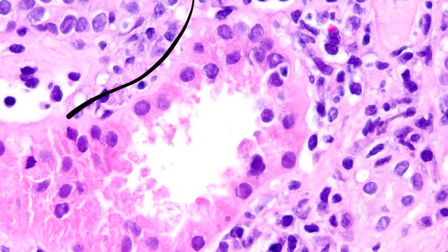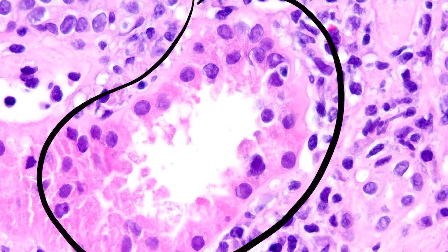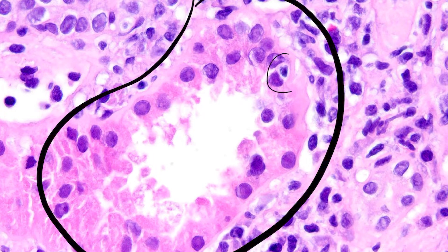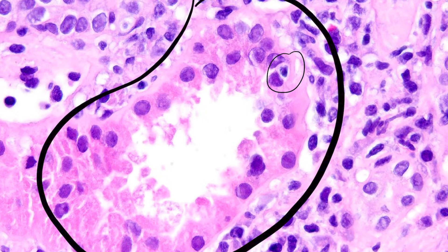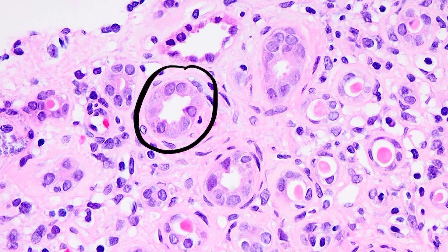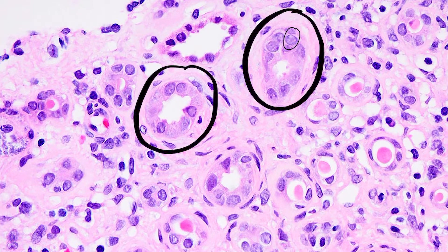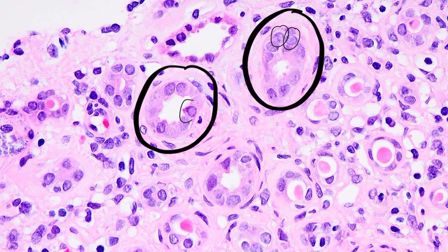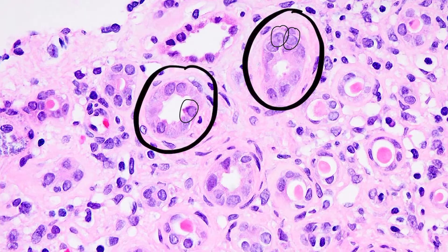In addition, we had frequent non-atrophic tubules that showed lymphocytic tubulitis, which at first glance would be concerning for acute T cell mediated rejection. However, as we look at other tubules, we can see nuclei with a somewhat glassy appearance consistent with viral cytopathic effect.